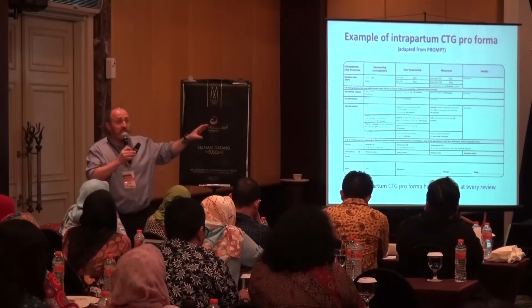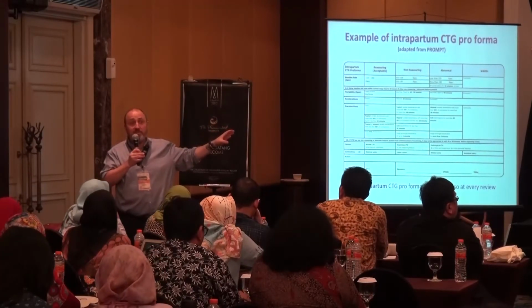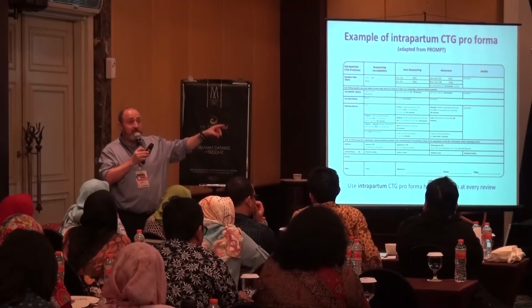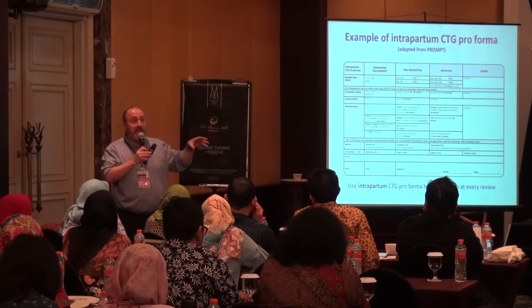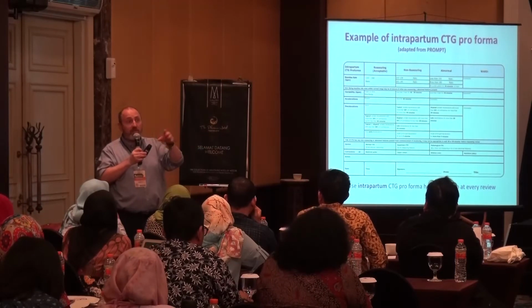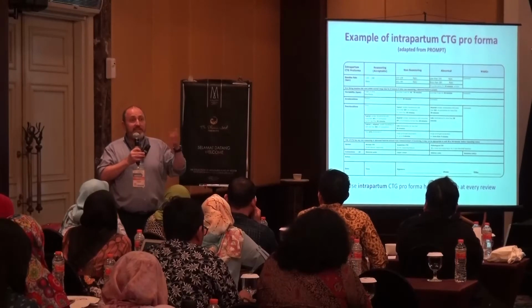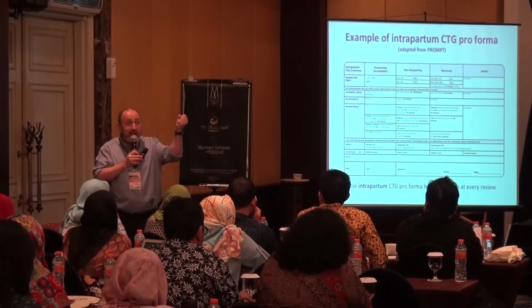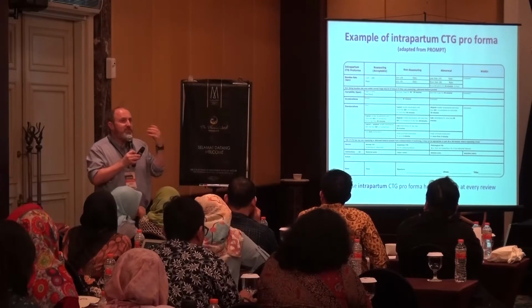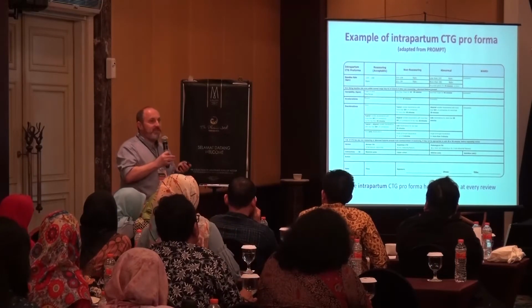So I encourage you to try to prepare some of those. I'm happy to share a PDF of that with Rena, who can pass it on. We've passed that on to our 19 maternity units in the area we work with. They all use this now. They send it to the printer and it gets printed up. Actually, some of the units made a stamp. Just stamp it on the page. But it makes it really easy for you to do your interpretation.